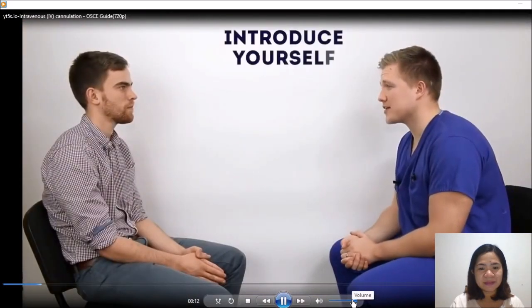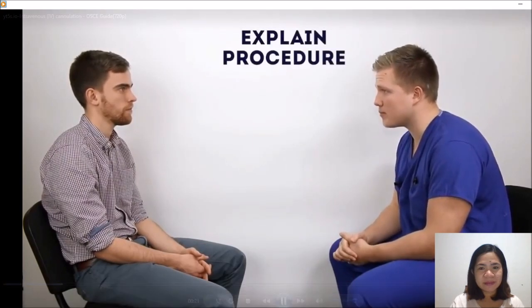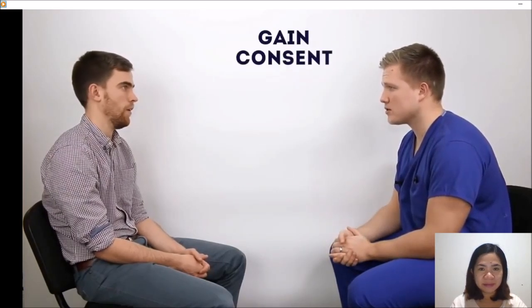Hi there, I'm Andrew, one of the final year medical students. Could I confirm your name and date of birth, please? Sure, it's James, 13th of December 1989. Nice to meet you, James. Today I've been asked to insert a cannula into your arm. It's a small plastic tube that will allow us to give fluids and medication. It might be a bit uncomfortable, but it won't be painful. Is that okay? Yes, it is, yeah. Brilliant. Are you allergic to anything at all? No, not that I know of. Fantastic.